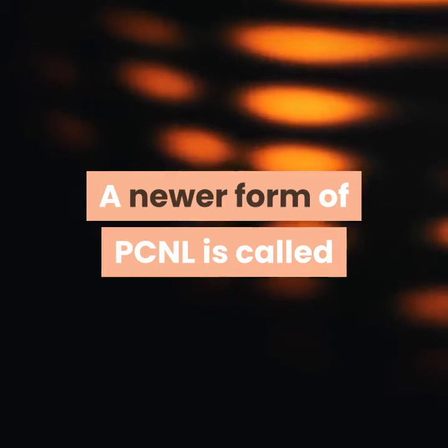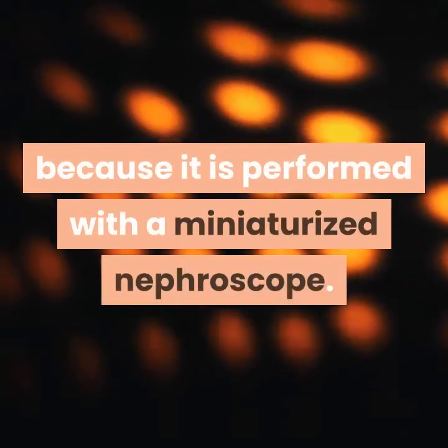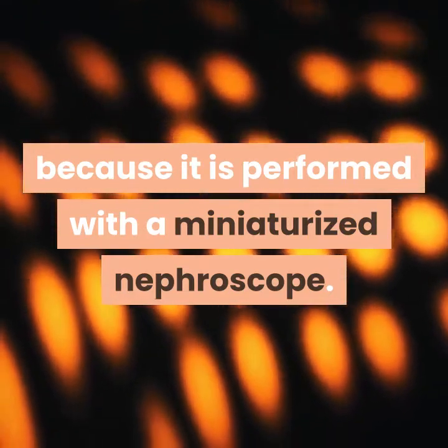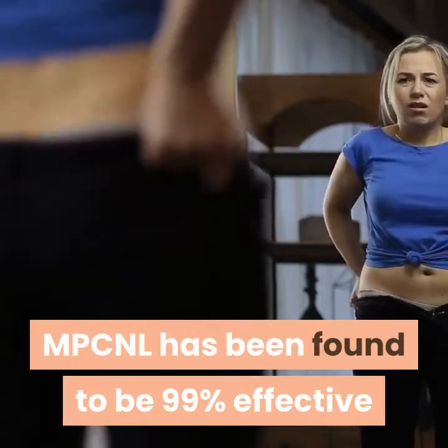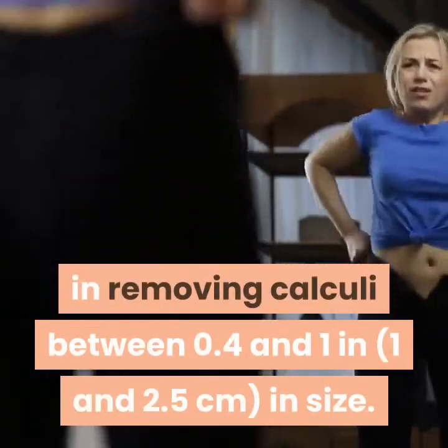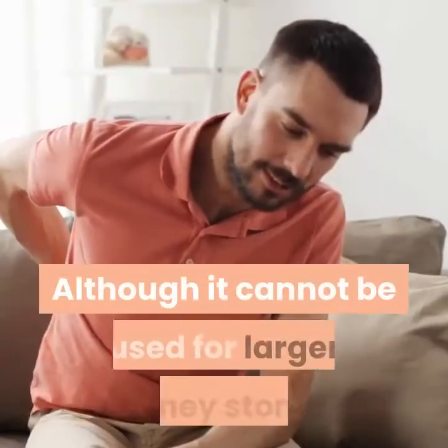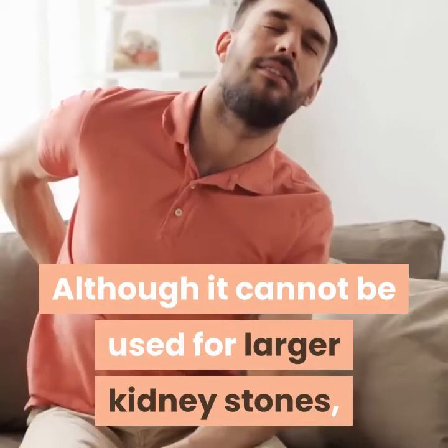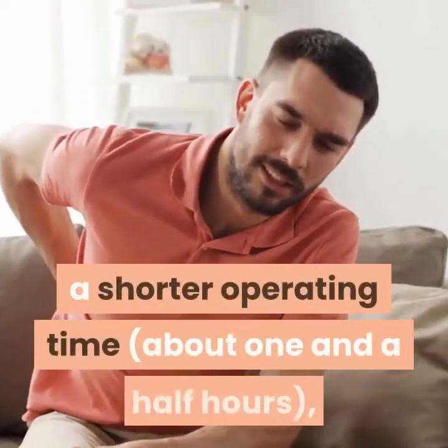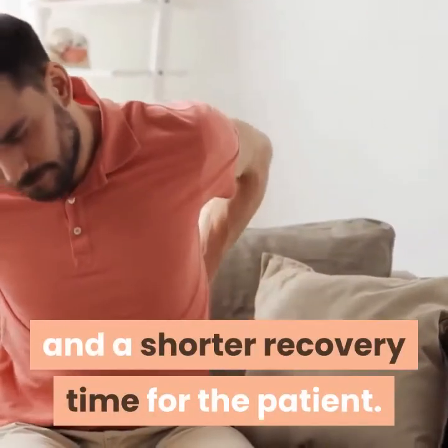A newer form of PCNL is called mini percutaneous nephrolithotomy (MPCNL) because it is performed with a miniaturized nephroscope. MPCNL has been found to be 99% effective in removing calculi between 0.4 and 2.5 centimeters in size. Although it cannot be used for larger kidney stones, MPCNL has the advantage of fewer complications, a shorter operating time, about 1.5 hours, and a shorter recovery time for the patient.